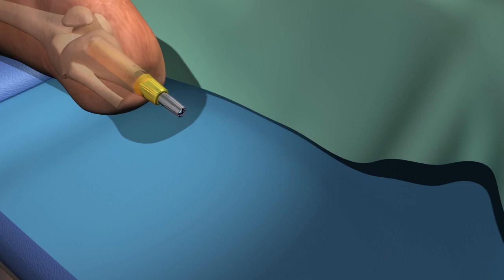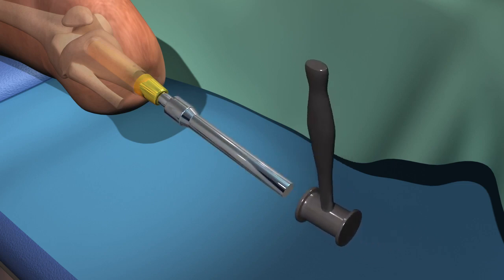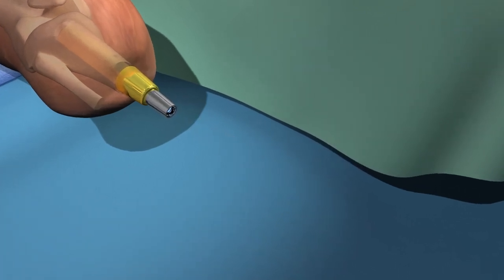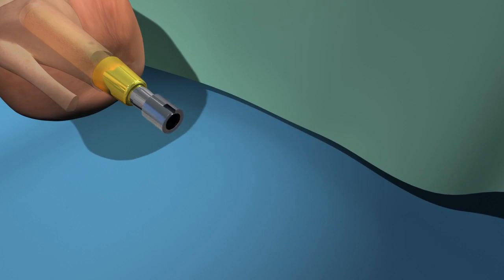A dual cone connector is applied, followed by the rest of the components of the abutment.